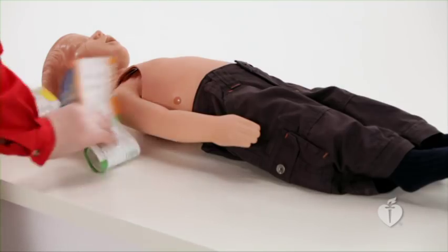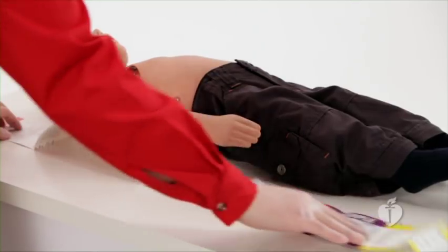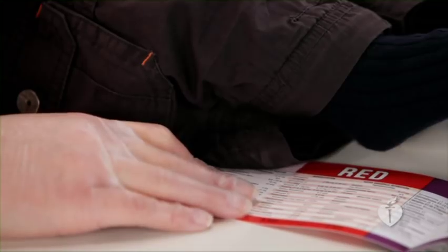Special care and expertise are necessary to maintain cervical spine motion restriction during intubation if spinal trauma is suspected. Proper endotracheal tube and other equipment sizes and medication doses are often best estimated with a color-coded length-based tape. Measure from the top of the head to the heel.